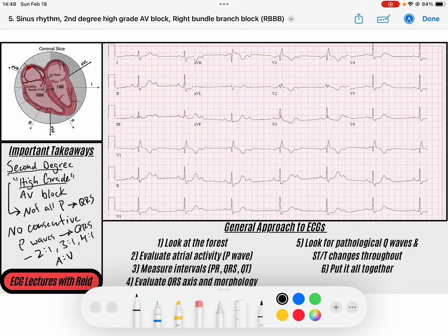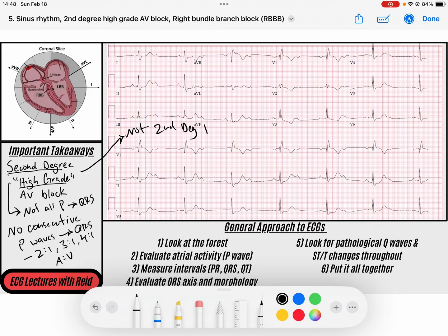It's a big misconception that these are second degree type 2 blocks — they are not. You might get taught differently, but these are properly called second degree high grade AV blocks. Now let's look at this ECG.